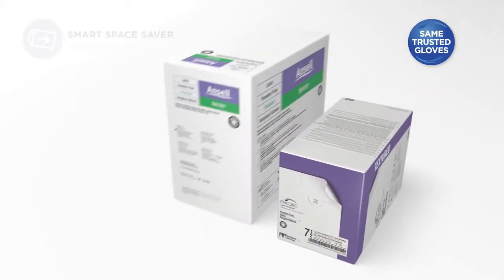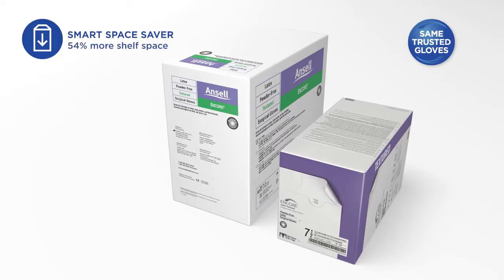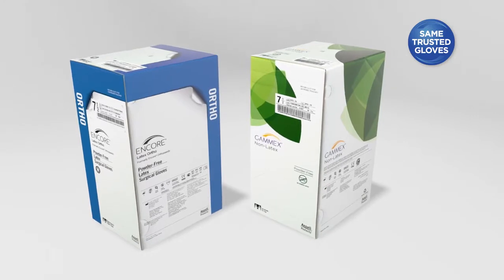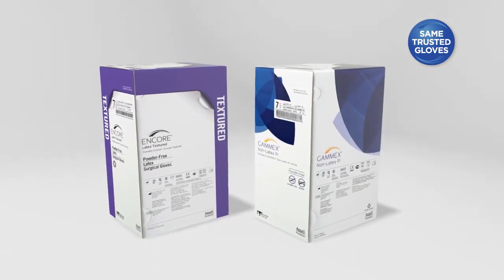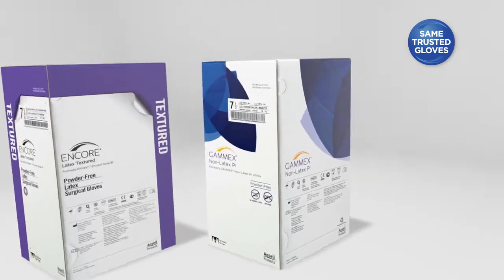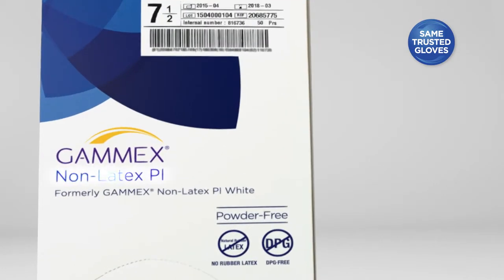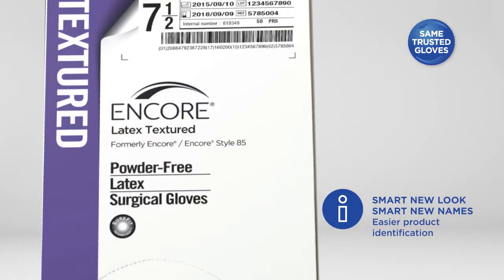We shrank our dispenser packs. We worked closely with our users to come up with a modern, eye-catching design, color-coded for each style for rapid identification on OR storage shelves, and we changed the names in order to better describe their specific properties. This makes it easier to select the right gloves for your surgical requirements.